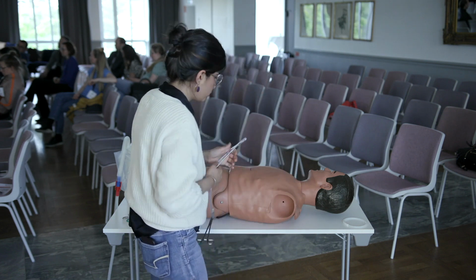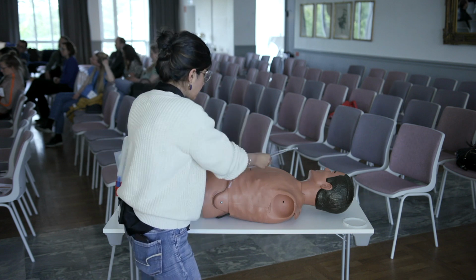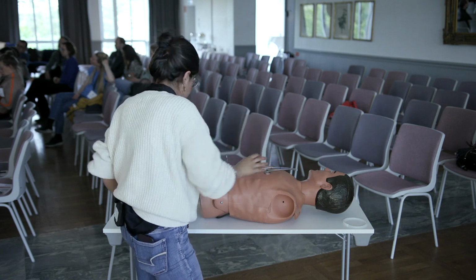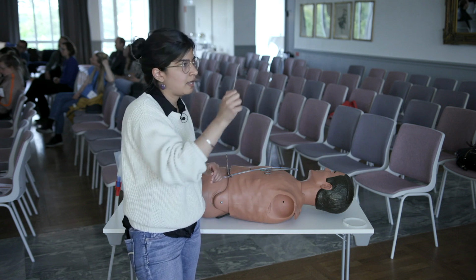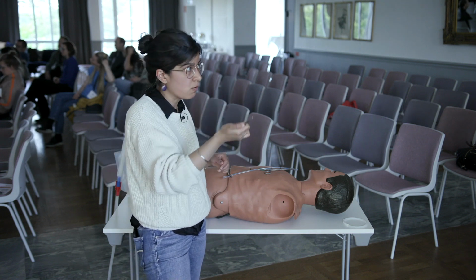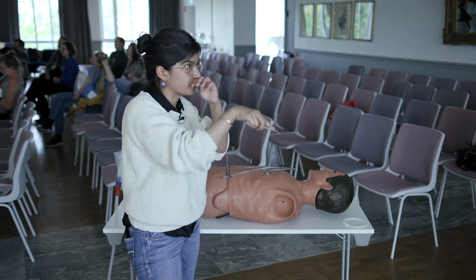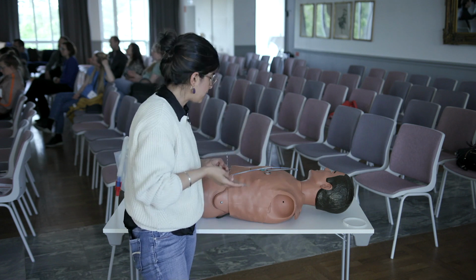Okay, so then you're ready, your lidocaine has taken effect. Aside from these 2 clamps, you always want to have the smallest clamp available because it's small, so you can manipulate it more, but it's also the finest tip, so you can pop through the pleura more easily.